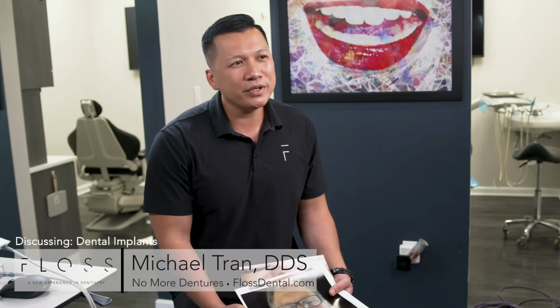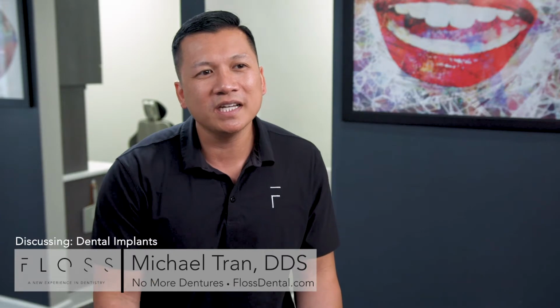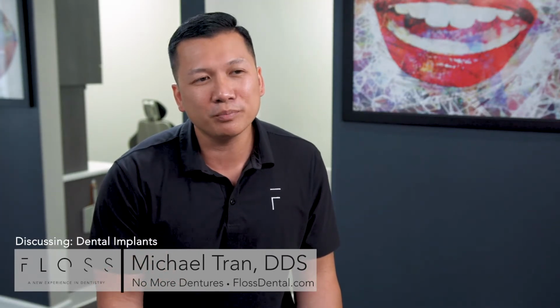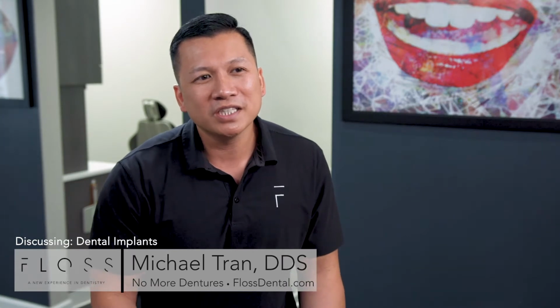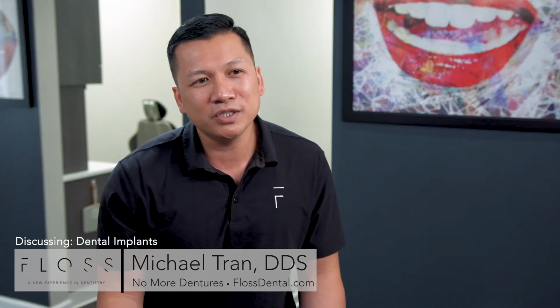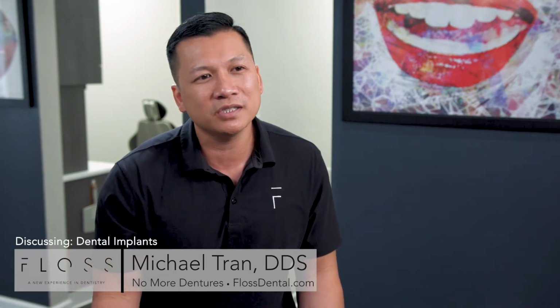So for him, this is what we did. We did all of the planning like we usually do. We took our 3D x-ray, we took our photos, and we designed his surgery on the computer. What does that mean for him? So when he came in, we took out his teeth and we had a surgical guide that's matched up to his jaw. That allows us to do a surgery very, very quickly. We did his surgery in an hour.